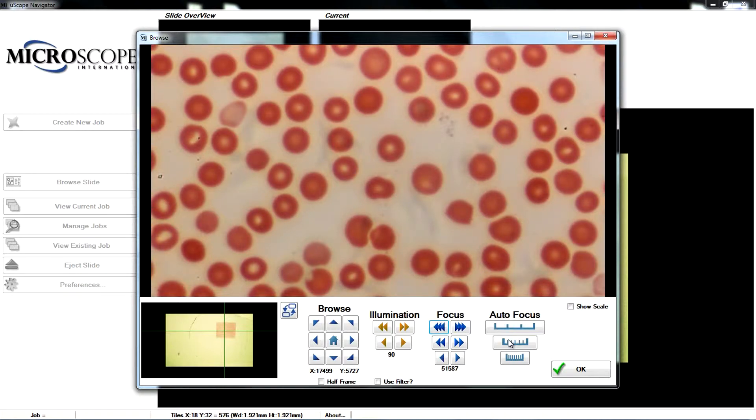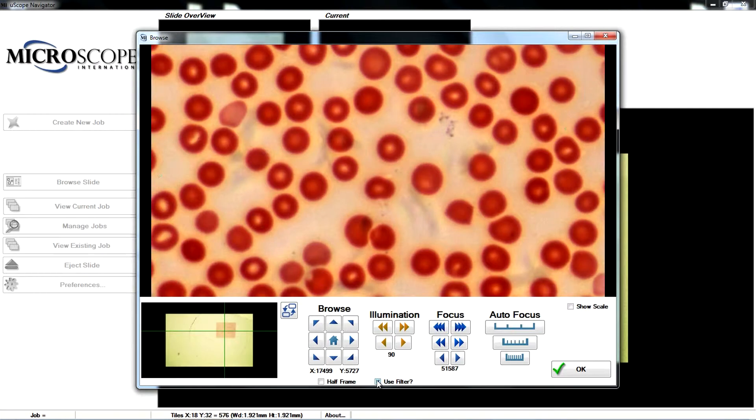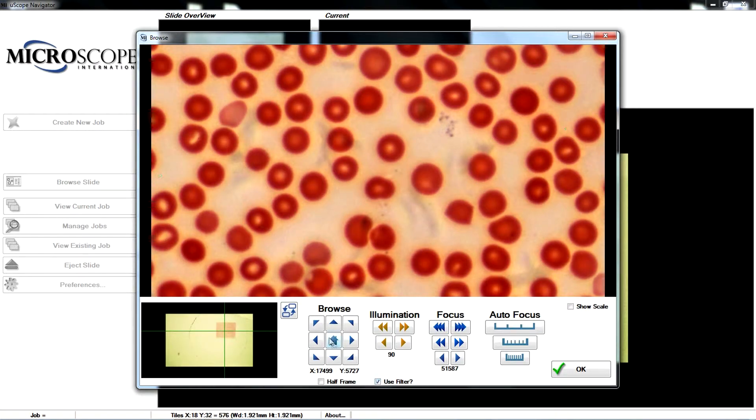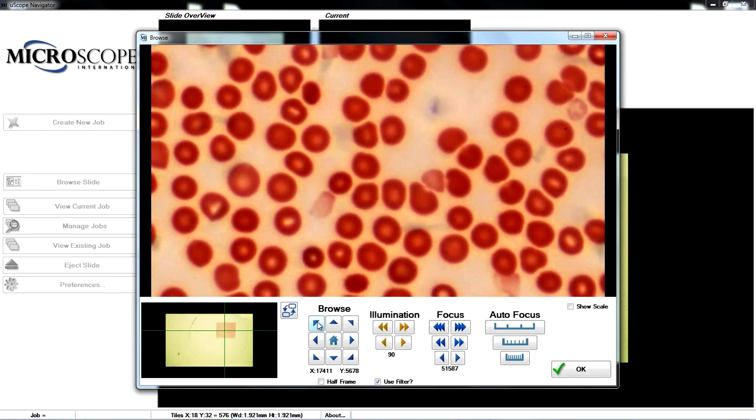You may apply a user-defined image processing filter to the display to suit your requirements. Use the direction buttons to move around the slide.